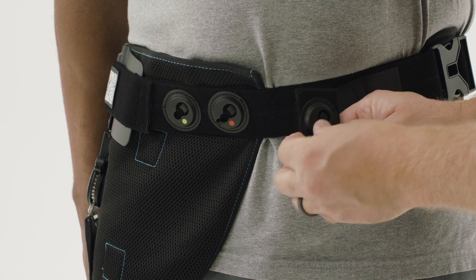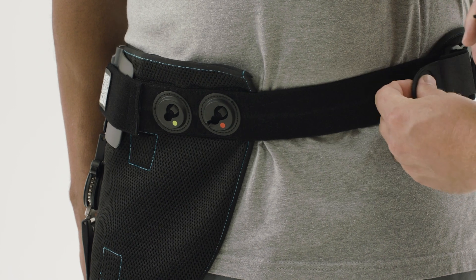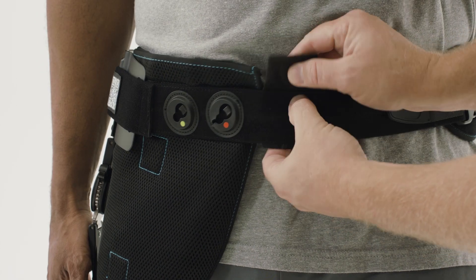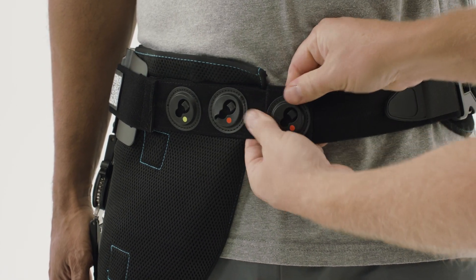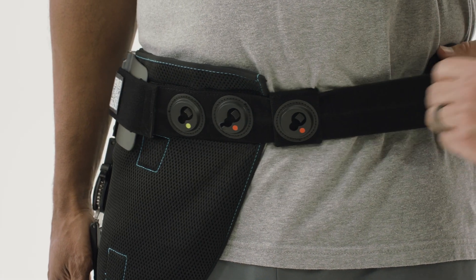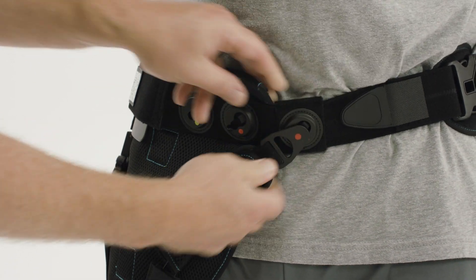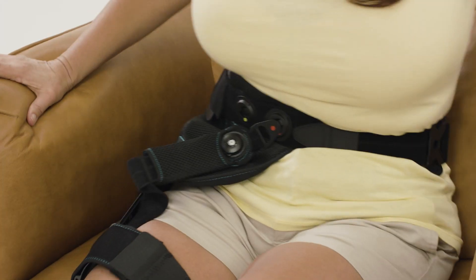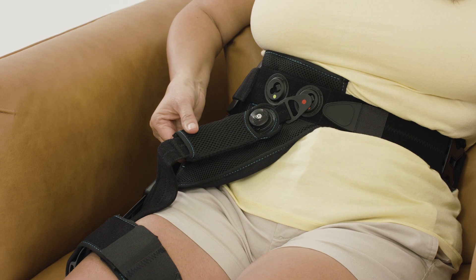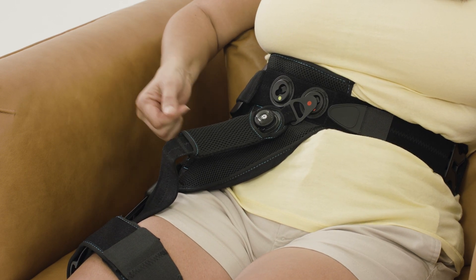The sewn seam should be on the top and each keyhole is slightly angled. Find the appropriate keyhole and place it on the waist strap as close as possible to the original keyhole. Even if the rotation strap has been trimmed, the strap should still be able to attach to the new keyhole. Make sure to instruct the patient not to over-tighten the straps or tighten them while seated. The straps are meant to disengage and become loose when the hip is flexed or the patient is seated.